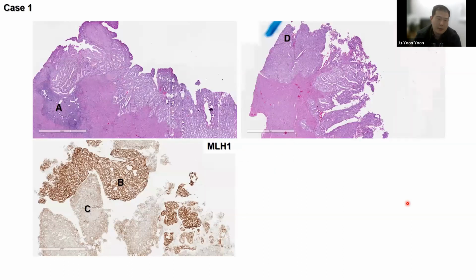Anyway, going back to this case, one of the reasons I brought this case to this forum is that I looked at different regions within the hysterectomy, which is the top, as well as the biopsy. Going back to the hysterectomy, I found this little region where there was histologically normal endometrium, with the neoplastic endometrium on top of it. And here we have that area with the spindle morphology where it's just full-out carcinoma. Then B and C were areas in the biopsy where I saw intact expression of MLH1 in B, and C where it was deficient in MLH1.